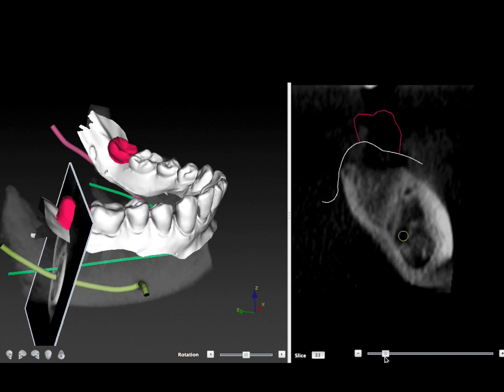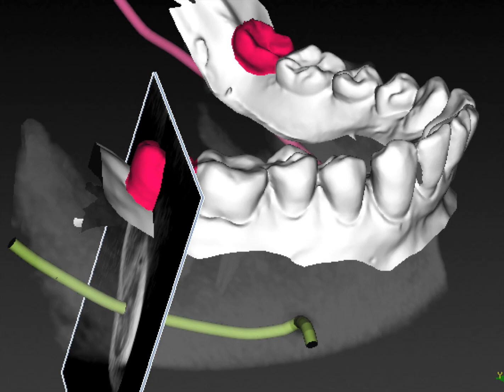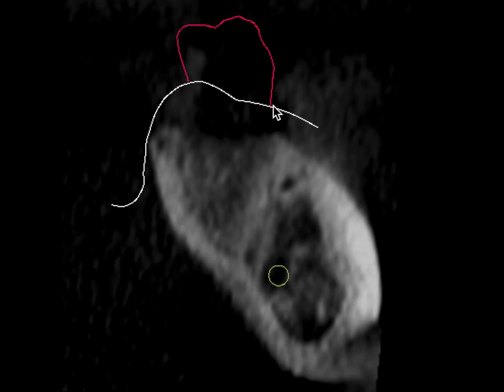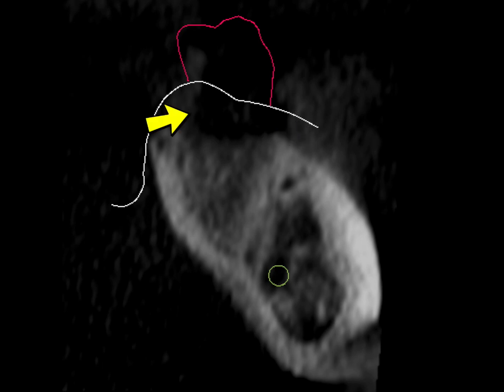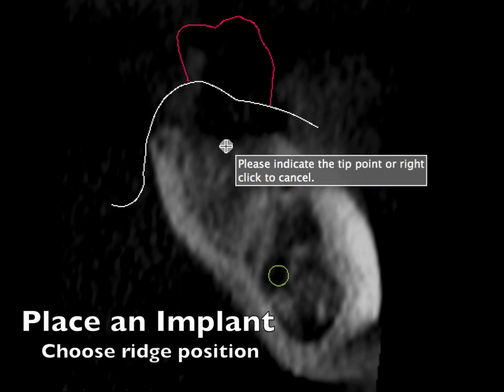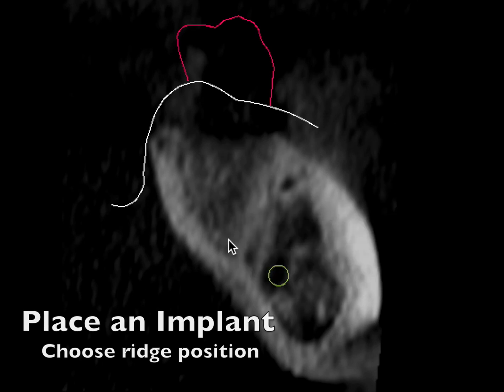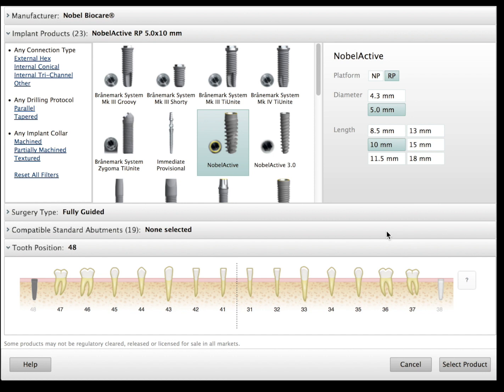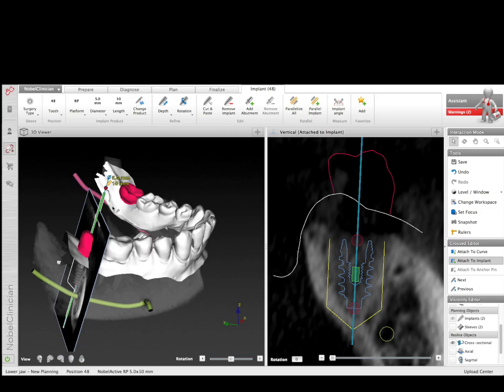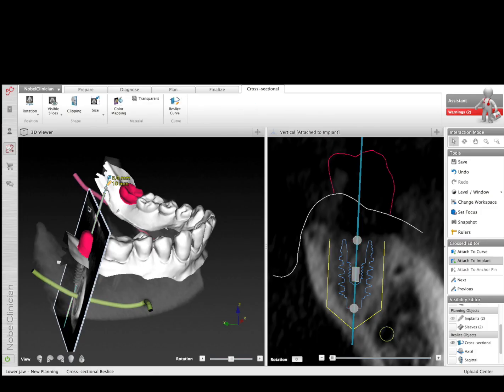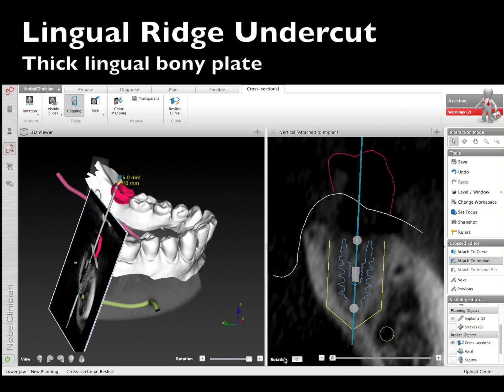The neat thing about this software is we can angle it to the root and then move back into the area where we're going to place the implant. This allows us to have a cross-sectional view of where we want the crown to be and also the soft tissue thickness on the buccal versus the lingual — there's a lot more tissue on the lingual in this case. We're going to place an implant by choosing a ridge position, picking two spots, and this allows us to pick an implant instantly. We're going to pick a Nobel Active — the 5.5 will be available soon, but today we'll use the 5.0.